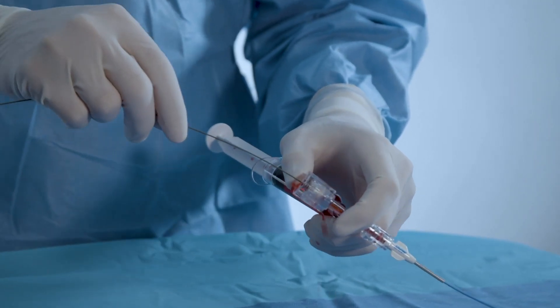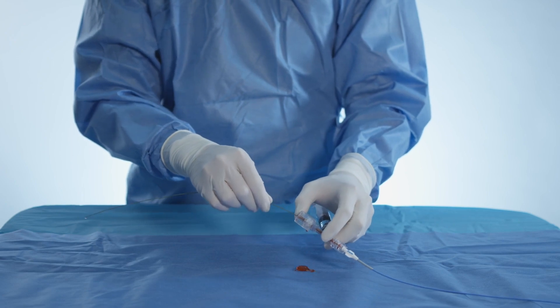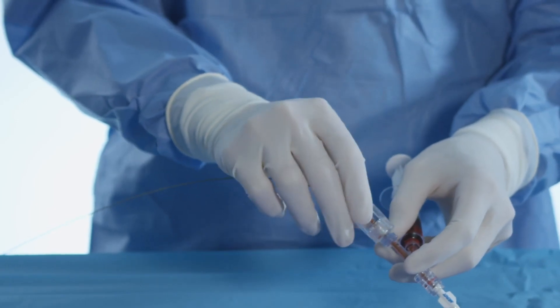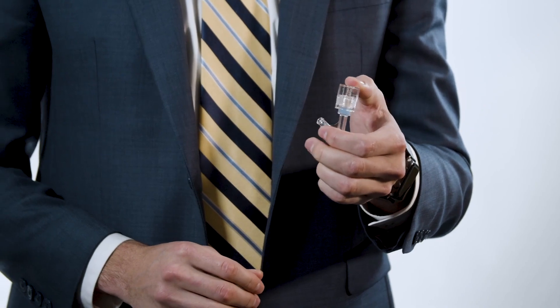When using this valve, insert interventional equipment into the top of the device and close the valve gently around it. The secondary bleed back seal can be manipulated by pushing down on the top of the device, making it easy to manipulate interventional equipment while controlling bleed back.